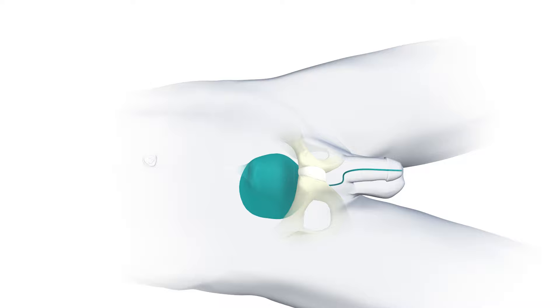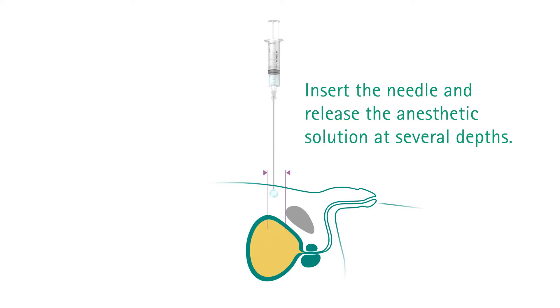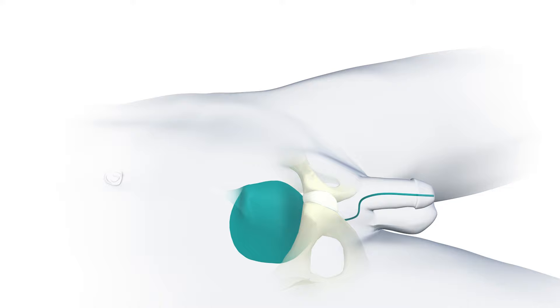At the start of the procedure, you can anesthetize the targeted area with the needle and the previously prepared syringe. Insert the needle and release the anesthetic solution at several depths.